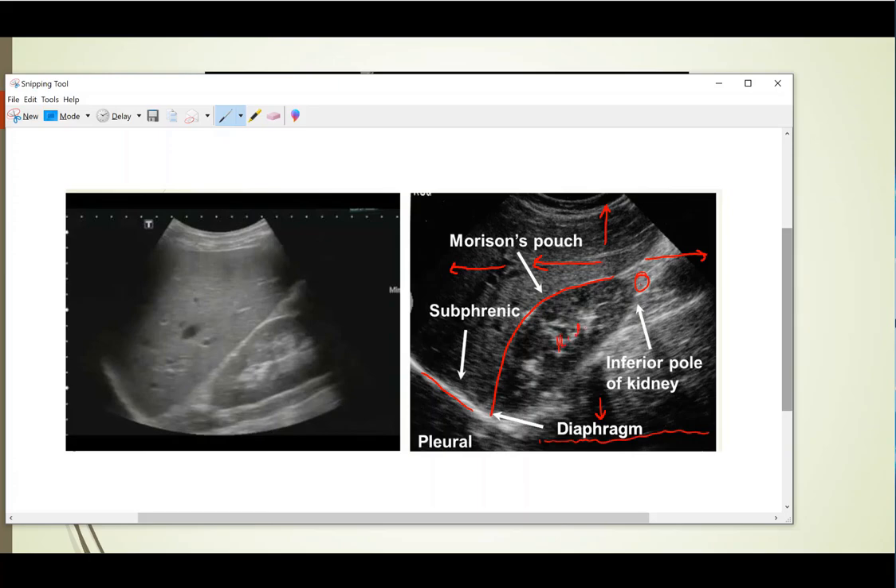And of course, this is the kidney. You can see on this picture that Morrison's pouch is right here, this is the liver, this is the kidney, and this is the spine. This is the diaphragm, and you can see there's no fluid here — but you still can't call this negative because you're not really seeing the inferior pole of the kidney or the caudal tip of the liver. You need to make sure that you move inferior along that line and catch those to confirm there's no fluid or blood in those areas.